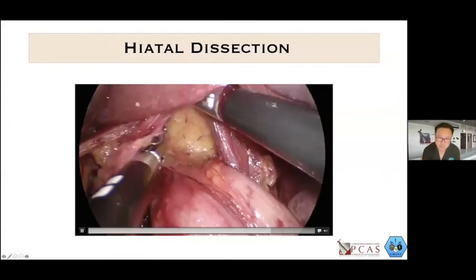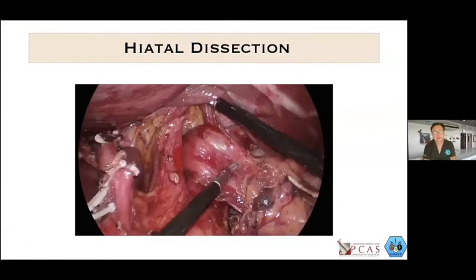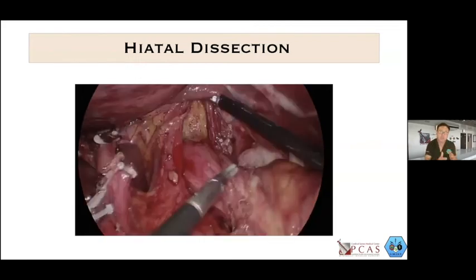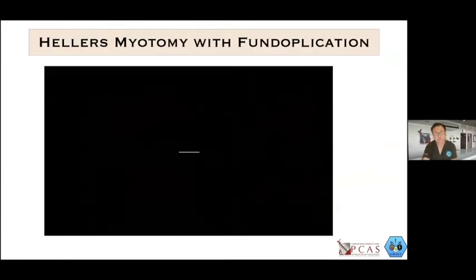So in the same manner, if you're doing your achalasia or even your dissection for esophageal duplications, you would want to lengthen that esophagus. The steps are basic and are repeatable in a lot of procedures, be it for achalasia, hiatal hernias, duplication procedures, or even gastric cancer procedures. So these are repeatable procedures that you can actually learn through time.